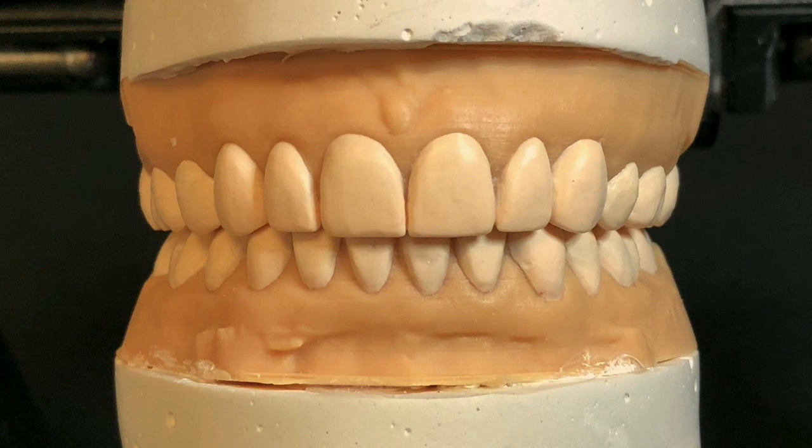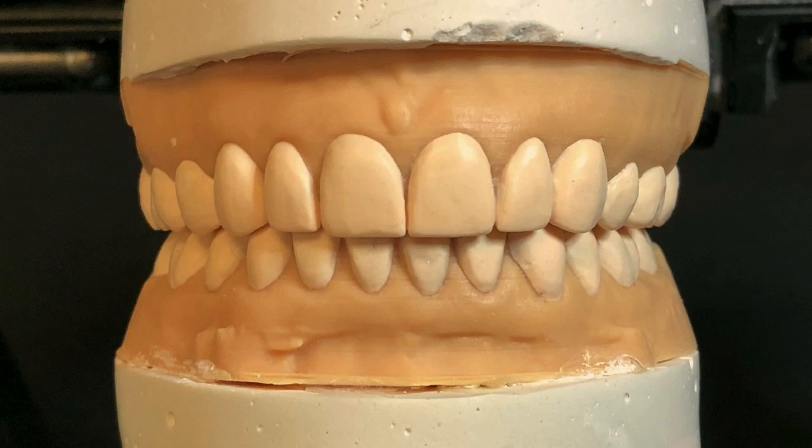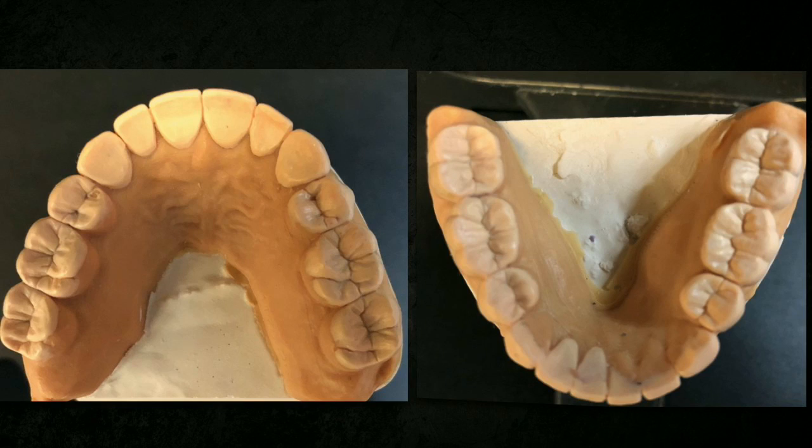In today's world, this can be done both with wax or digitally. This is a beautiful wax up, just analog wax up. And you can see, with just about a 3 millimeter, 2.5 millimeter opening at the pin, how much, without taking anything away, we were able to add back what she's lost on her lingual contours.